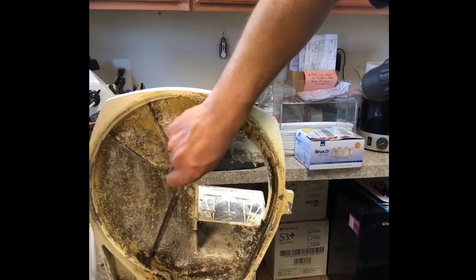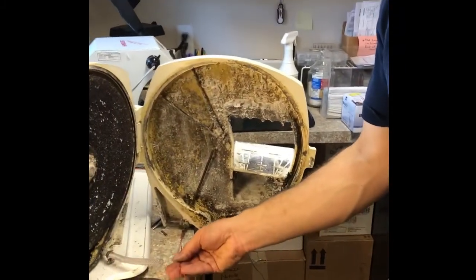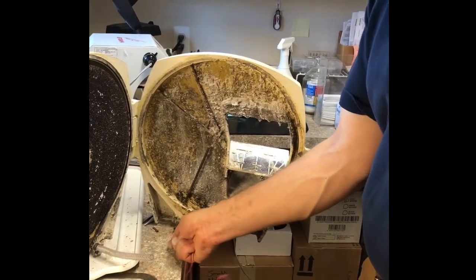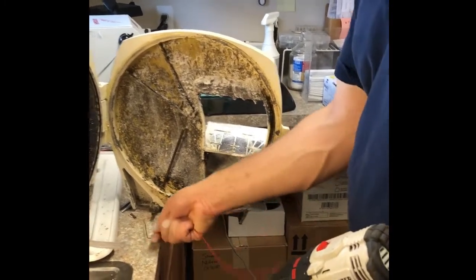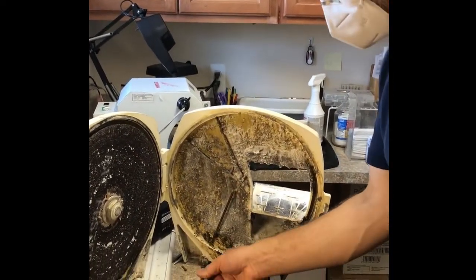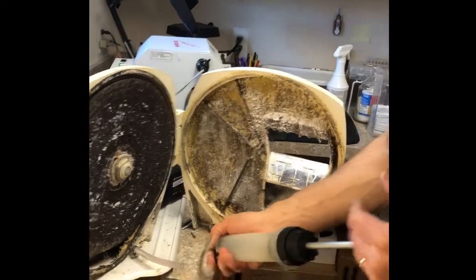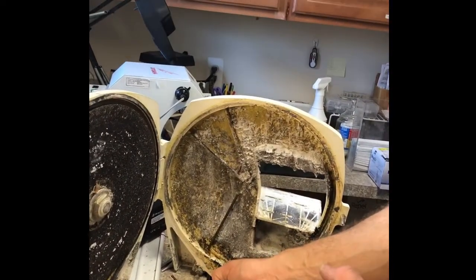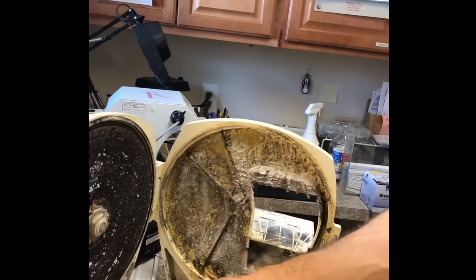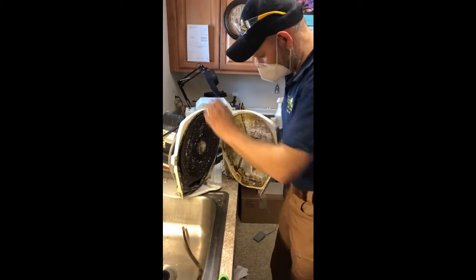All right, got a little bit there. What we'll do is just do the same thing from the front. All right, and then we'll just check it with this. Let's see if you're able to dislodge anything. Oh yeah, look at that. That's definitely a lot better flow. I can feel a lot that's clear. So we're going to check it with water now. It was definitely not doing that before.